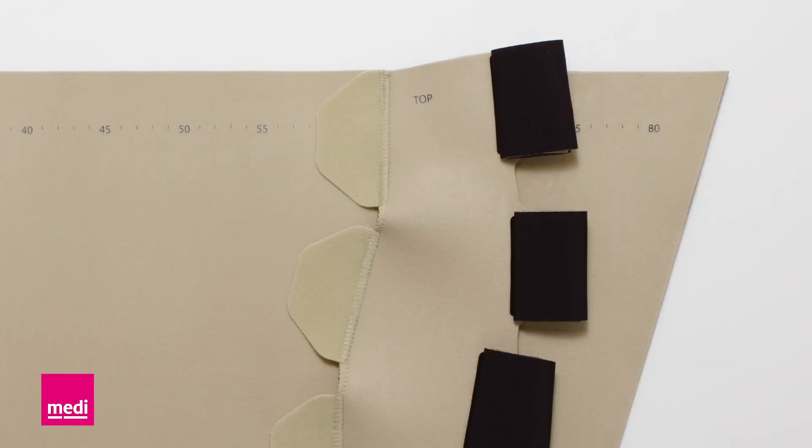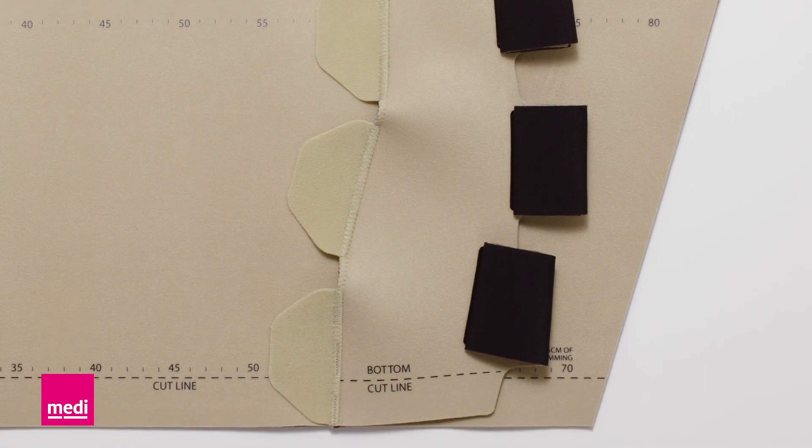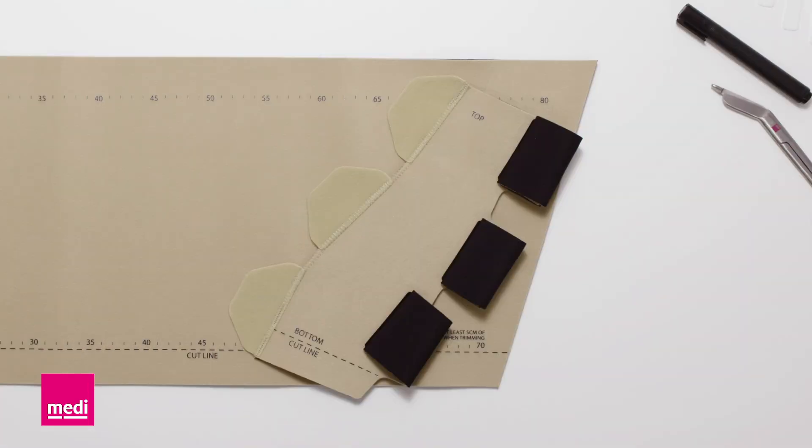Unusual limb shapes may cause small creases, but these will not affect the compression. In case of large differences between both circumferences, the small component might not reach both edges of the large component. In this case, centre the component.